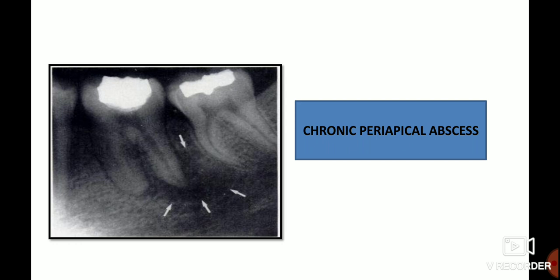The next case is chronic periapical abscess. Here there is ill-defined periapical radiolucency involving the distal root of 36, which is the significant feature of chronic periapical abscess. Acute periapical abscess has not been discussed because, except for slight thickening of the periodontal ligament space, there is usually no radiographic evidence of its presence.